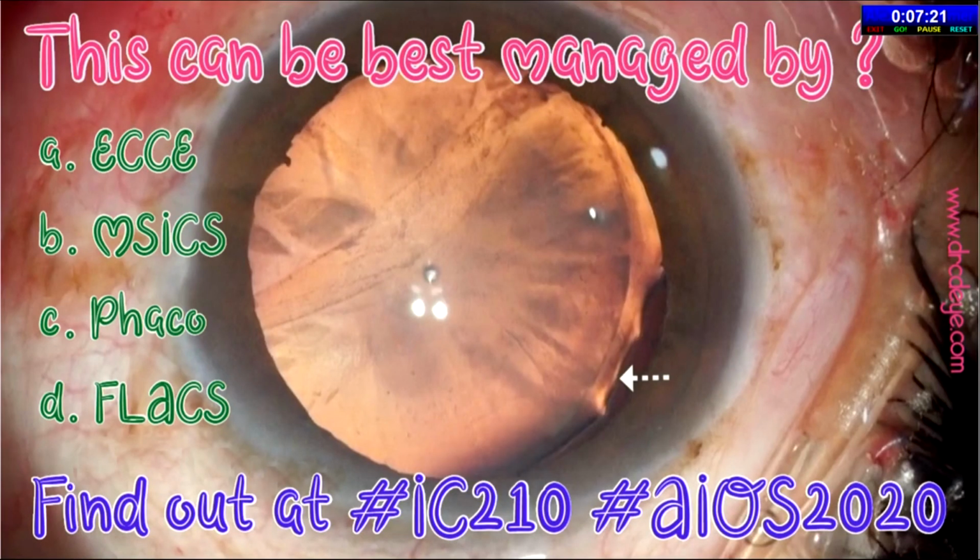And what about this last one? A, B, C, D. Yes, I think again it's D and probably combined obviously with C. So this is how we choose the correct method for the correct patient, cataract grade and situation.